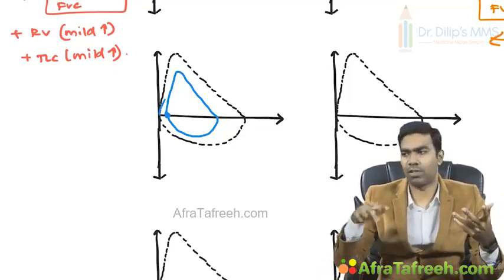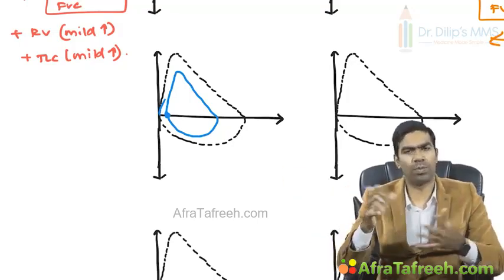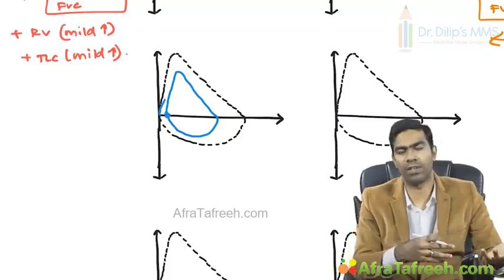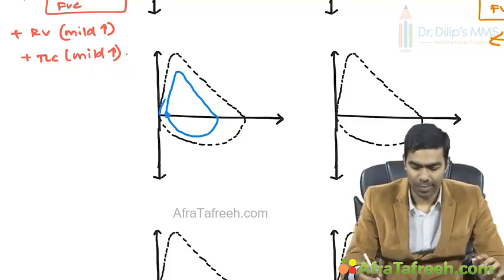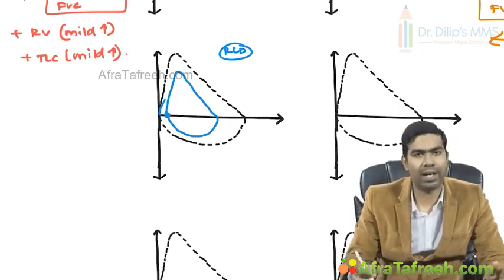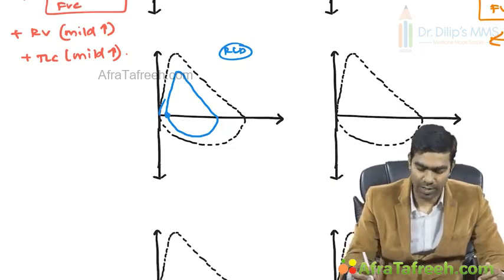It's all about the curves, because you're going to get multiple curves. There is nothing like superimposed. Just to show what is normal and differentiate abnormal from normal, I'm showing all this. So this is a typical curve of a parenchymal restrictive lung disease, what you are seeing here.